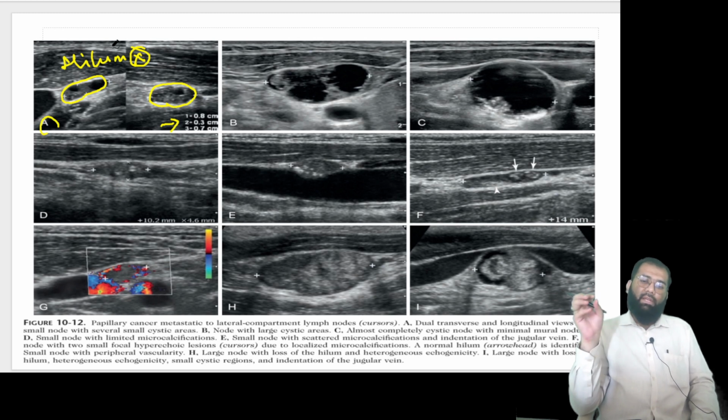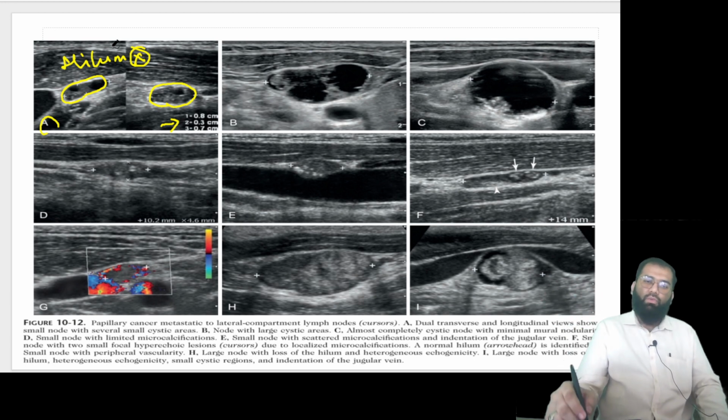So sometimes the patient might present with lymphadenopathy. That might be the presentation. They might give a clinical diagnosis of tuberculosis. If you see calcification, you might initially mistake it for cystic nodes or necrotic nodes of tuberculosis, but you should always look for thyroid. So if there are lymph nodes in the neck, look at the thyroid; if there is a lesion in the thyroid, look at the lymph nodes. Very important. That's the rule of ultrasound.